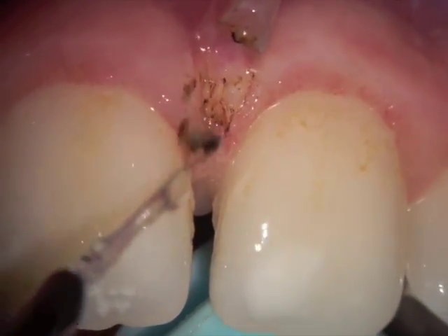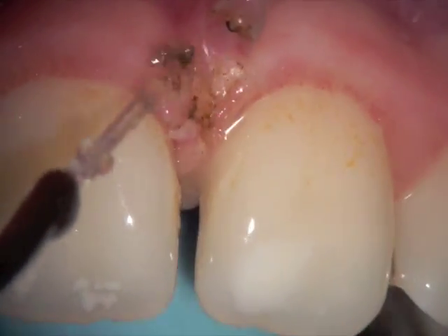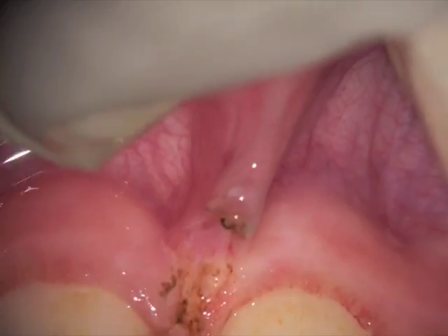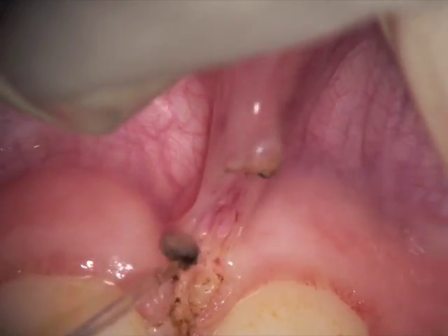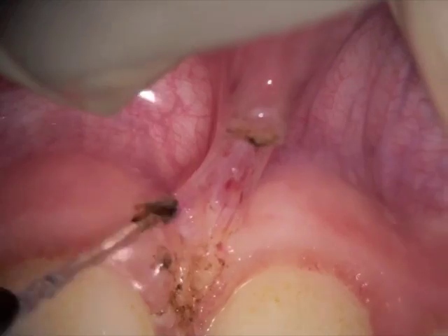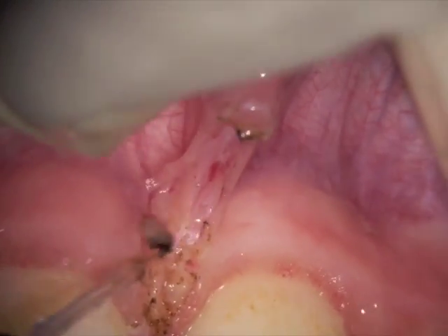I try and use the laser to superficially remove some of the fibers that were running in between the two teeth here. Now you can see that as it's releasing the fibers — with the upper lip pulling and the right hand cutting — we're slowly creating a diamond-shaped open wound.